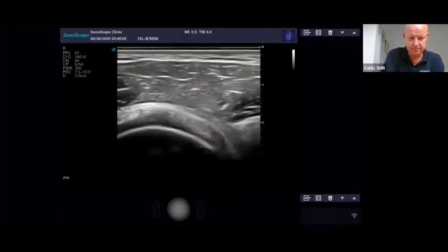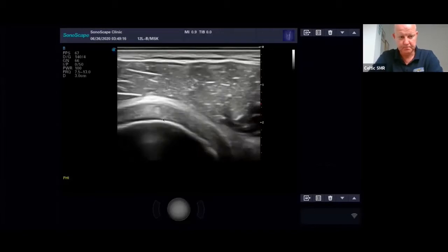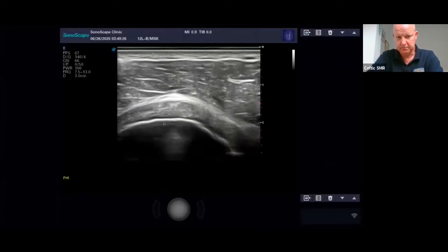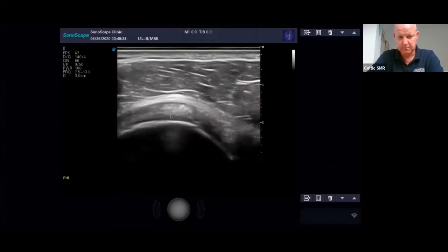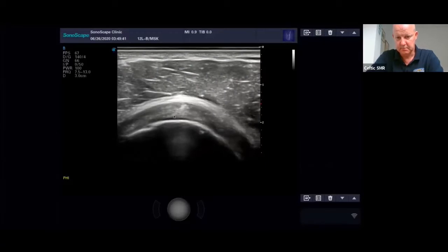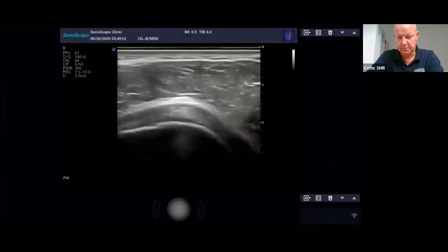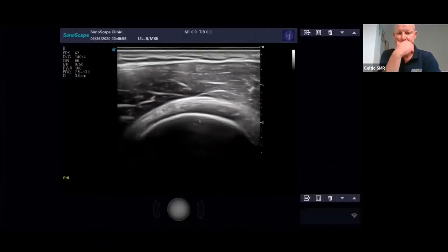Now, biceps is down here, so angle it here. You've got supraspinatus here, the bursal component, and this is the tuberosity here. This is a transverse image, so you think about the actual tendon coming at you. Rather than a long section, it's a transverse section, a cross section essentially. Again, know where your landmarks are for your anterior and middle facet, and you can see the difference here where the contour changes.